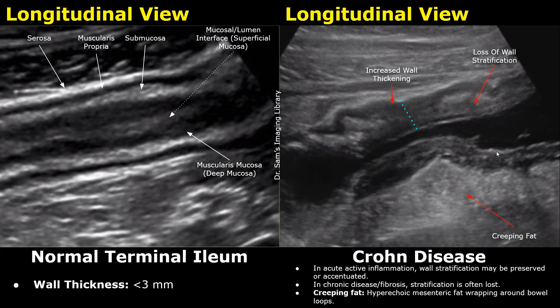Instead of distinct layers, we see a thick, hypoechoic, and heterogeneous layer. Some areas may appear normal, but in these areas the bowel wall has an abnormal appearance. Another feature is the presence of hyperechoic prominent fat surrounding the bowel loop, often called creeping fat. You can see this fat layer appearing very hyperechoic, almost like a solid mass next to the bowel. Normally, we will not see this prominent fat layer next to the bowel.